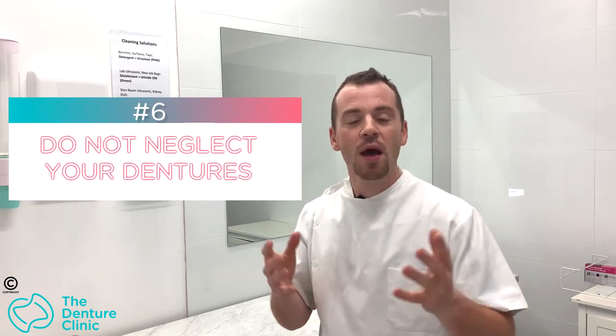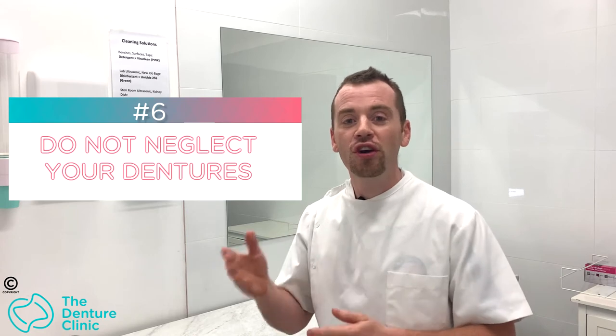Tip number six: don't neglect your dentures. What do I mean by neglect? Don't go two, three, or four days without brushing them. Don't eat every food under the sun, such as cold chocolate, really crusty breads, or biting into chicken bones — because these things are going to destroy your denture. We want to make sure we're maintaining a good cleaning routine.